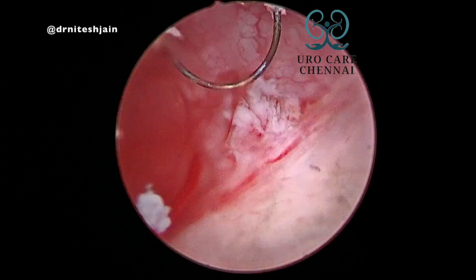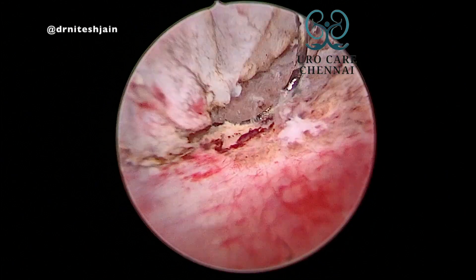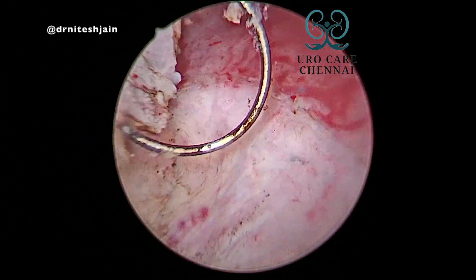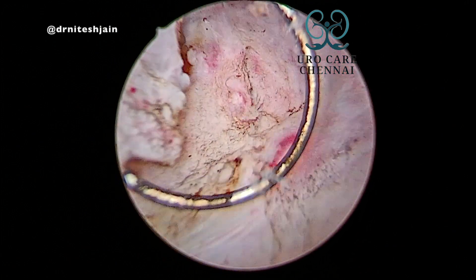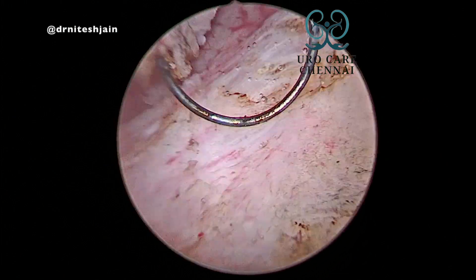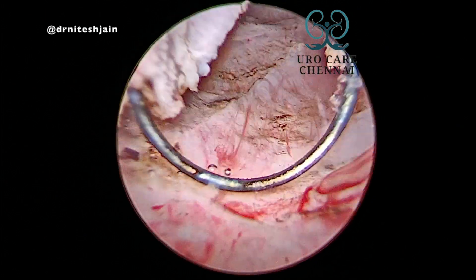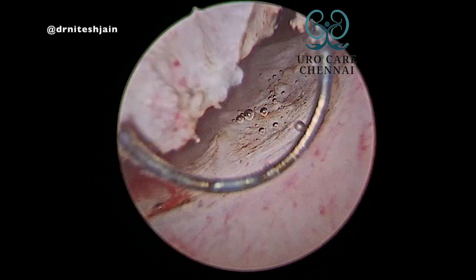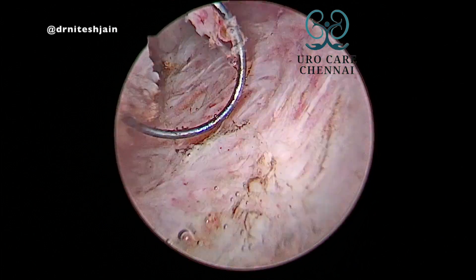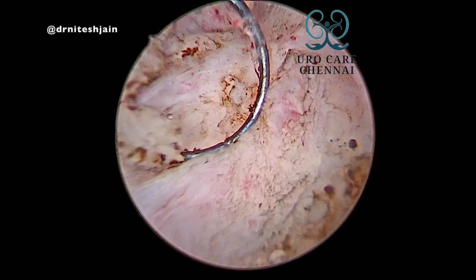Point coagulation should be done when we have not yet seen the VUJ. Any small tumour can be cut, but do point coagulation — don't do blanket coagulation. Try to identify the VUJ first before doing coagulation. Just do point coagulation wherever you see any bleeders.